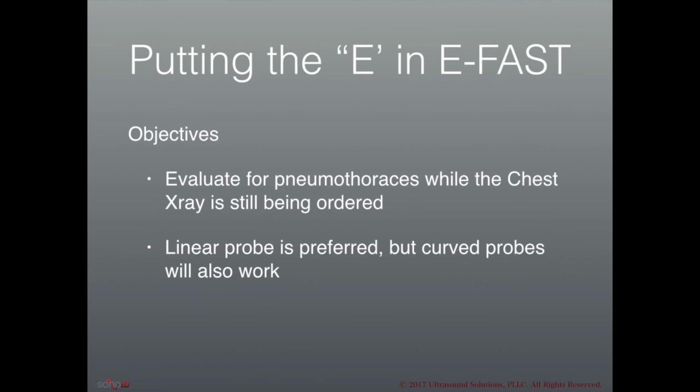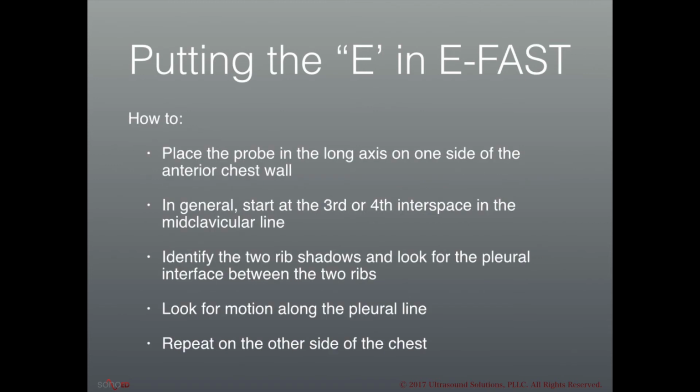In general, the linear probe is preferred, but the curved probes will also work, especially after you have more experience with this technique. To perform this exam, you're going to place the probe in the long axis or parasagittal plane on one side of the anterior chest wall.